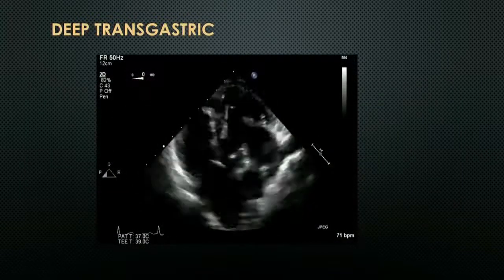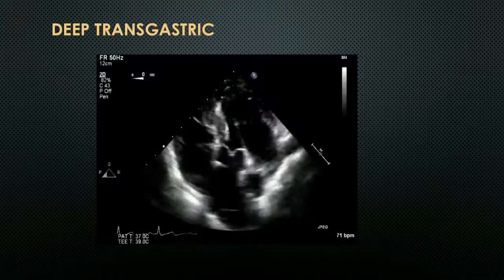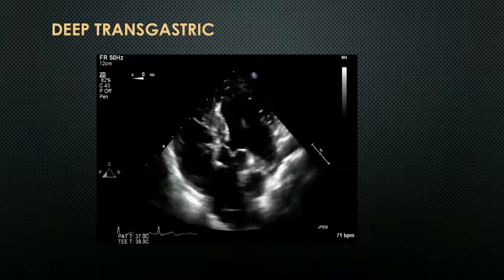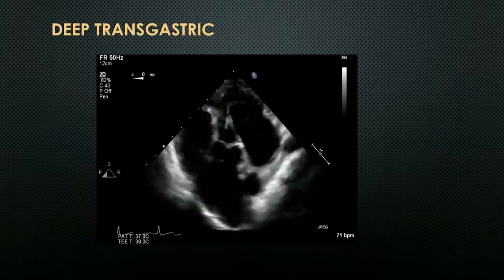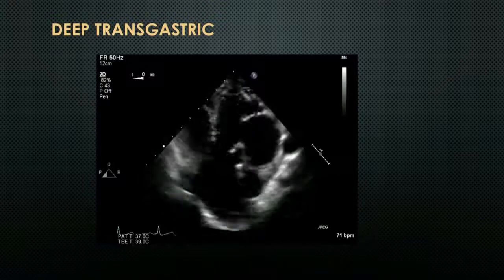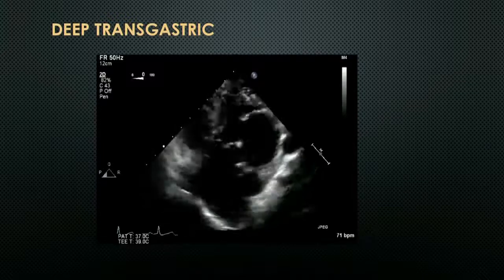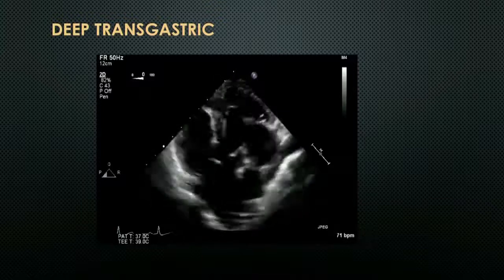Another view that you may be shown and that you should recognize is the deep transgastric view. This is about as good as we can get in terms of assessing gradients and flow across the aortic valve as well as across the pulmonic valve. If you advance your probe very deep into the gastric space and you anteflex very sharply, your probe is basically wrapping around the apex of the ventricle, and you are taking a picture that is approximately similar to an apical 4-chamber or an apical 5-chamber view.